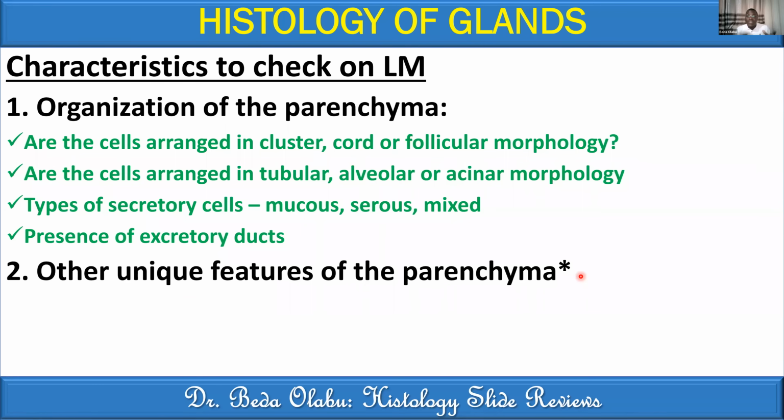So here I'm saying you pick any other unique feature of the parenchyma. If the parenchyma is lobulated, talk about it. If that's a unique feature, it may not apply to all, but maybe some may have that kind of lobulation. Talk about it.